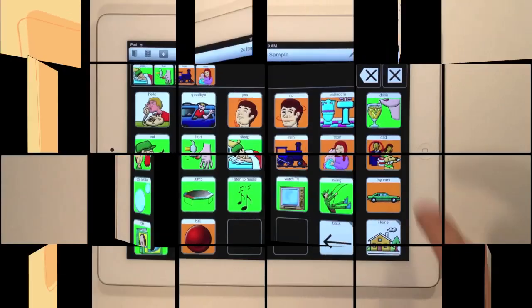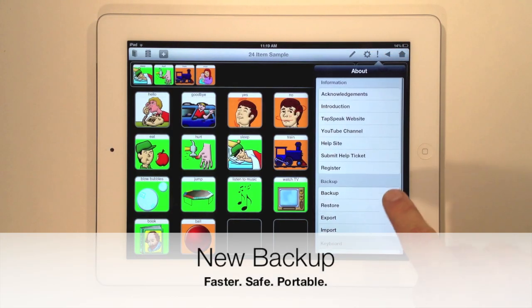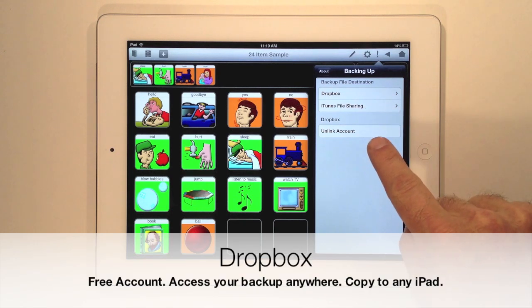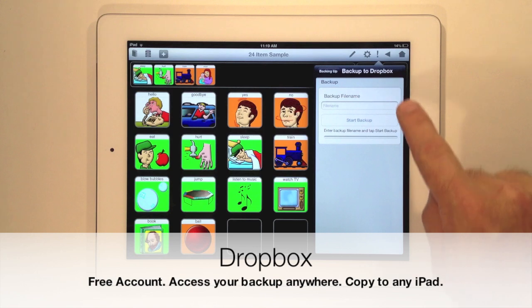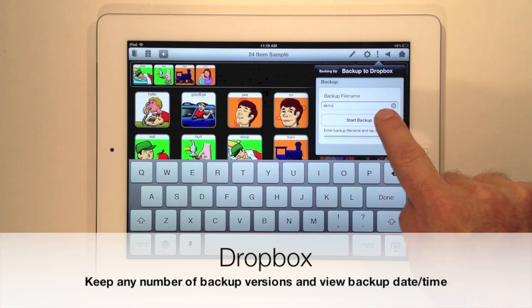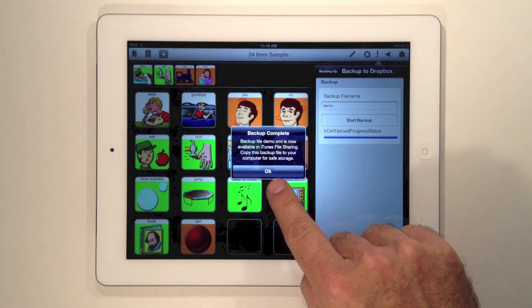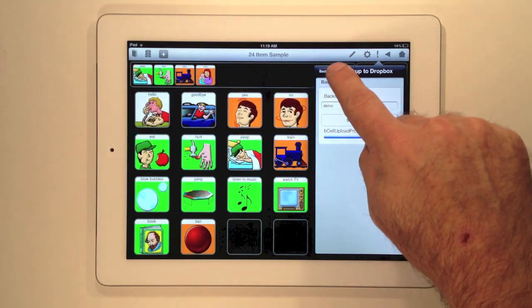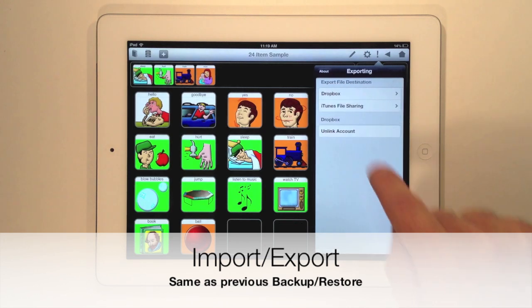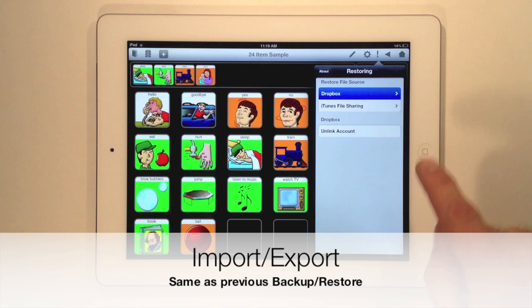We've added a new backup and restore system that's faster and more flexible than our existing systems. We've added support for Dropbox, which lets you save files to your own personal Dropbox account in the cloud and then access your backup from any location or computer. It also makes it easier to transfer setups between computers using the same Dropbox account. The export and import features in Tapspeak Choice 4.0 are equivalent to the backup and restore features in Tapspeak Choice 3.0, to retain compatibility with your existing backup files.